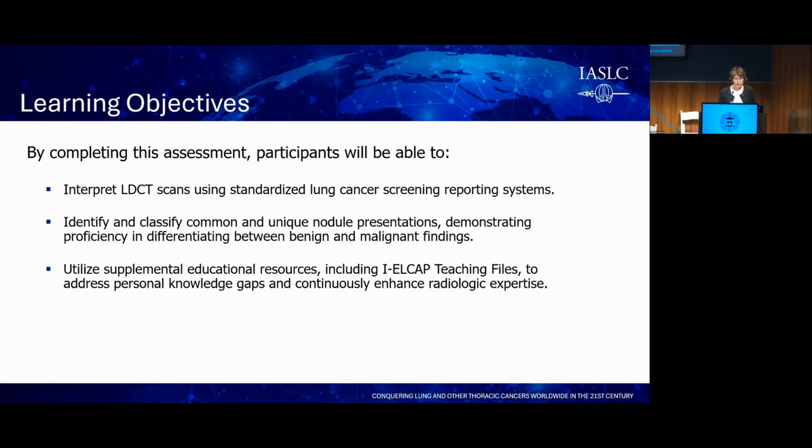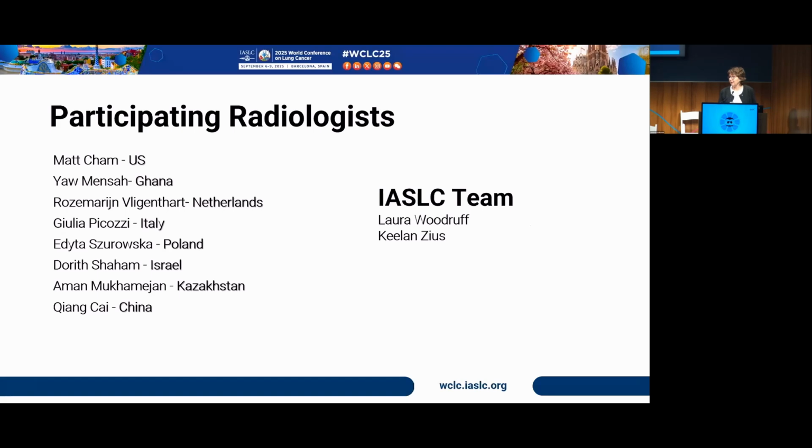So it will include both common and unique cases, as well as ancillary findings, same as in the teaching file. And the teaching file will be a supplementary tool for people who are using this self-assessment system.